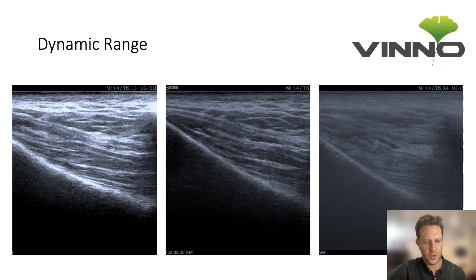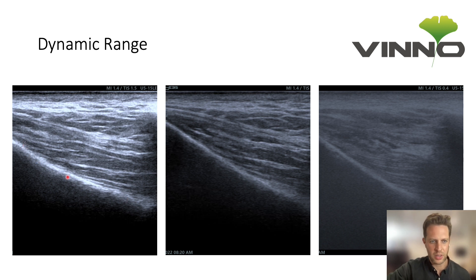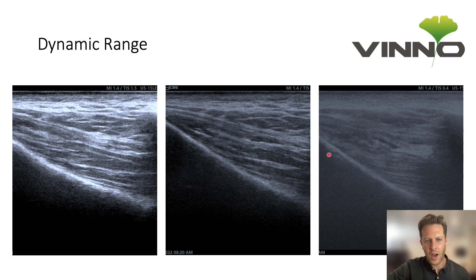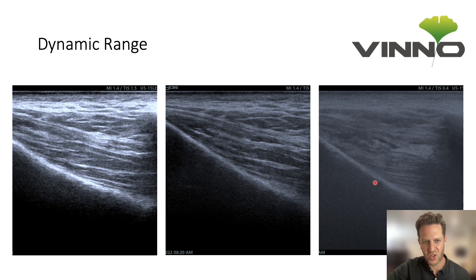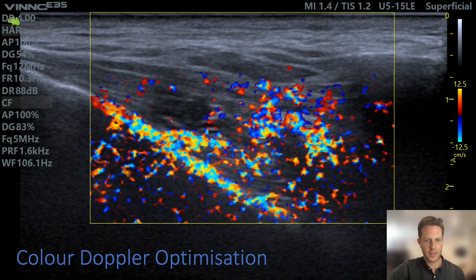Dynamic range is another button you can optimize. Dynamic range is similar to contrast. A lower dynamic range produces a very high-contrast image where you can clearly see the different fascial planes and layers. If you turn the dynamic range right up, you get more detail but the image becomes very soft. The optimal dynamic range is going to be somewhere between those two extremes.